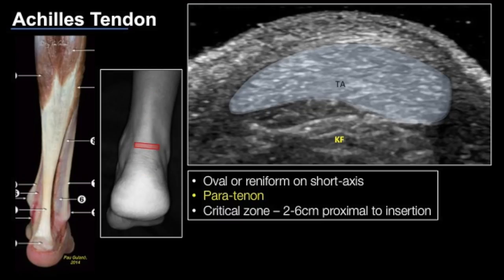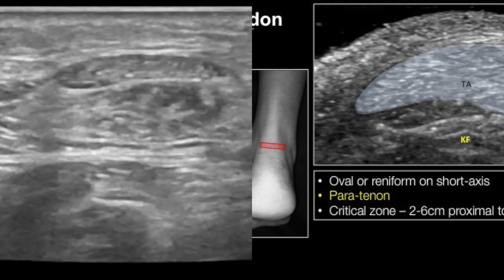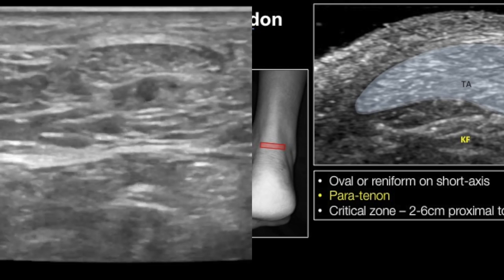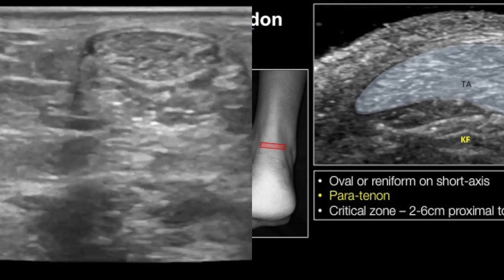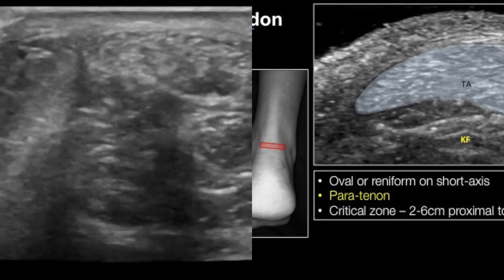On the transverse view or short axis, the Achilles tendon is seen as an oval or reniform structure with a typical brush-border appearance. The normal tendon does not have a tendon sheath; however, it is surrounded by connective tissue known as paratenon. The paratenon appears as a thickened or hypoechoic halo when there is tendinosis or a tendon tear, and it generally consists of blood vessels which supply nutrients to the tendon.